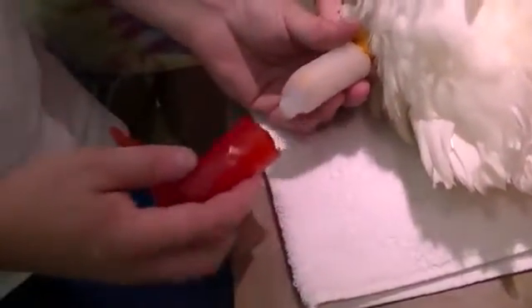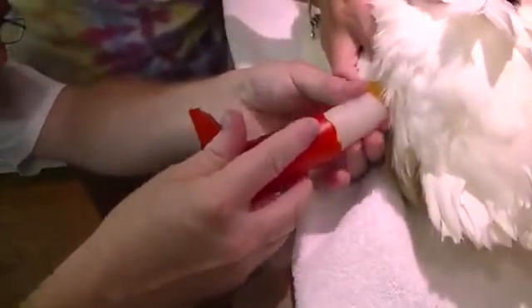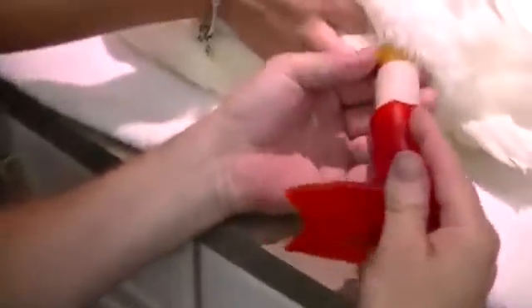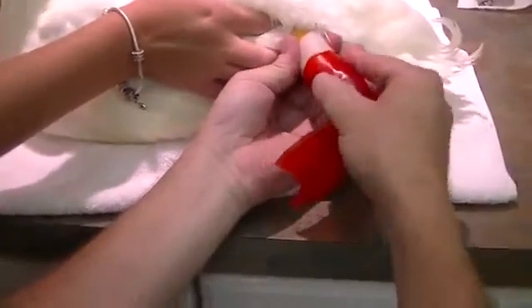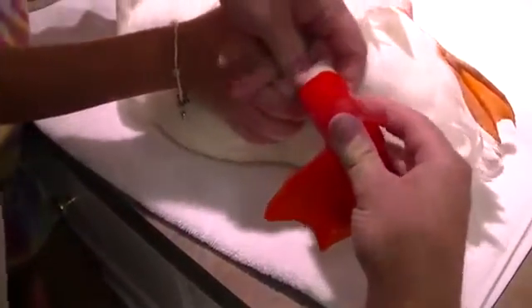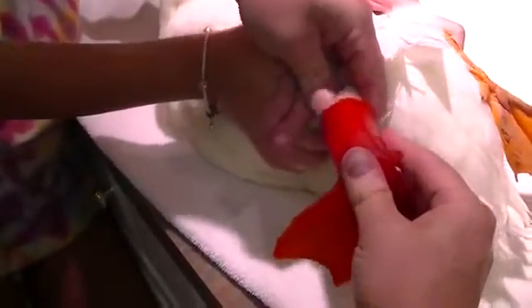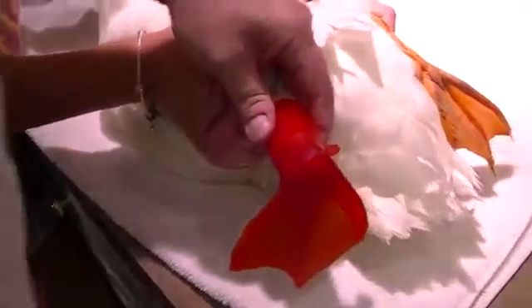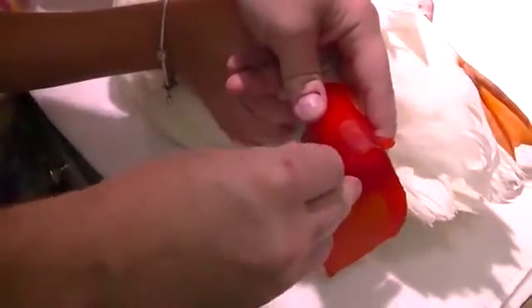Now we're going to take the foot and line up. Line that up. I'm going to cut. Push that up on there, and then put the screw in the side. And that goes in the bushing in the bottom.